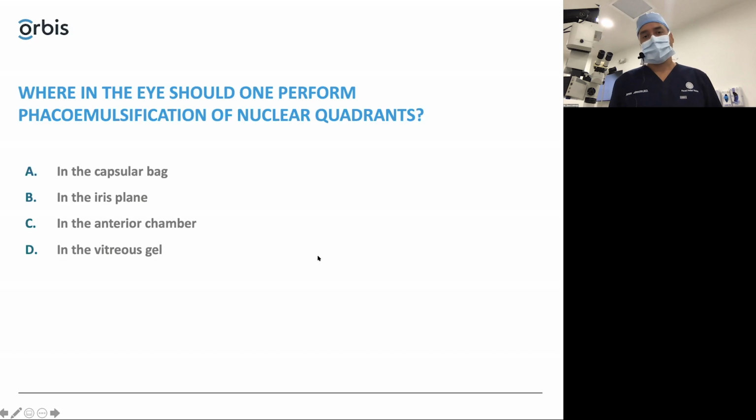In the bag, in the iris plane, in the anterior chamber, or in the vitreous gel? All right, in the iris plane. Man, my questions were too easy.